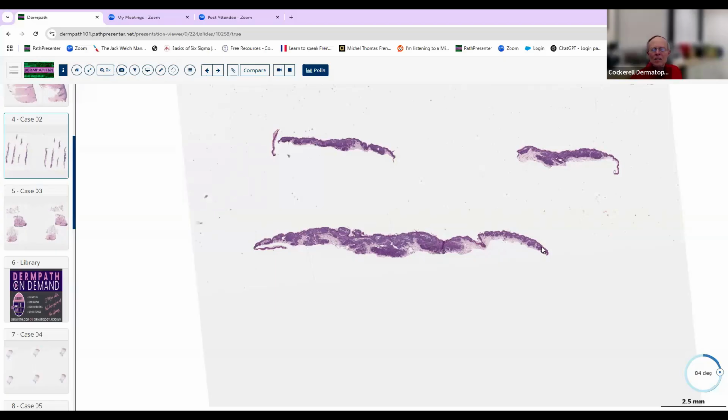It doesn't have a lot of features that suggest that this is the surface of a deep-seated iceberg, if you will. So looks overall architecturally benign. And again, I strongly recommend spending a couple of seconds at low magnification, going through that, and then ask yourself what kind of differentiation you're looking at as you go to higher magnification. So probably benign. Epithelial or non-epithelial?